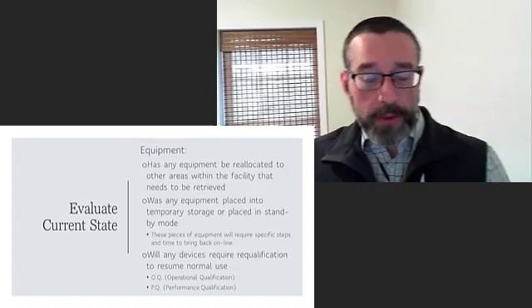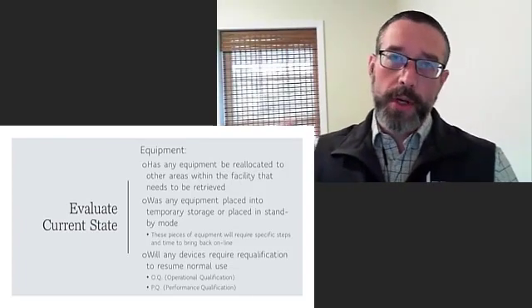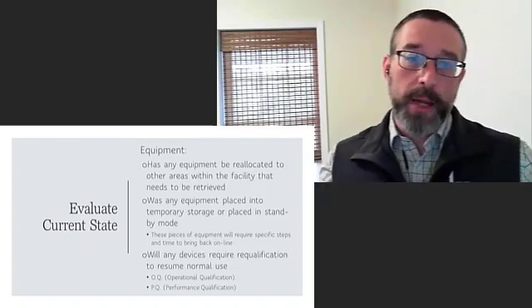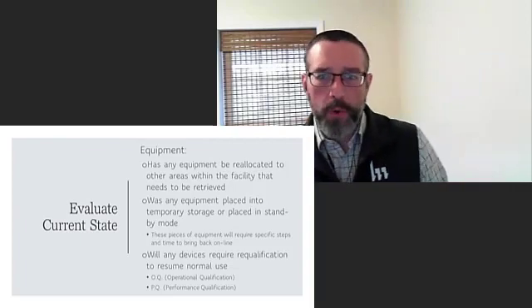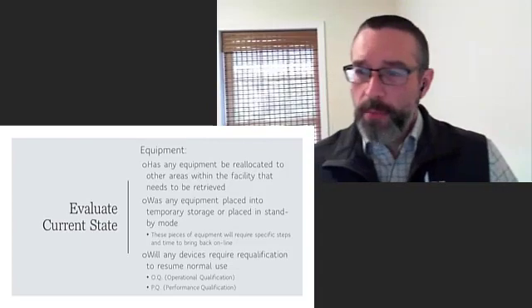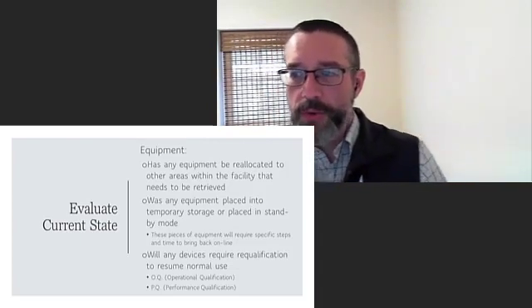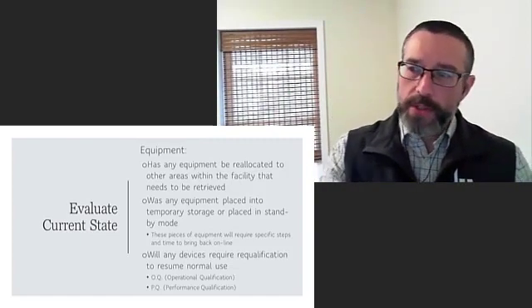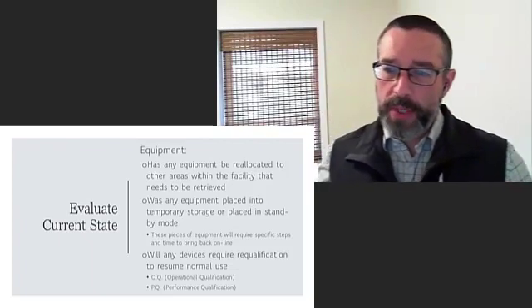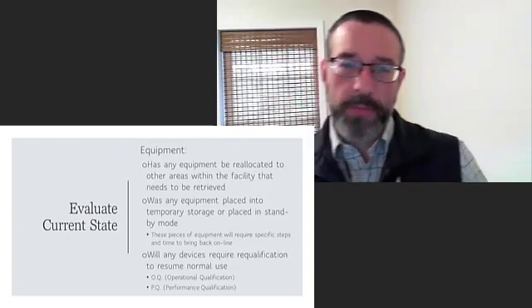What I find a little more interesting is this Belimed IFU, which takes it to another level and describes what happens if placing something in standby mode isn't done. Microorganisms form in the washing chamber, piping, and pre-wash tank on systems after a prolonged period of disuse. So they recommend performing self-disinfection after expiry of the programmed period, which is 24 hours as a standard, following the last programmed cycle.